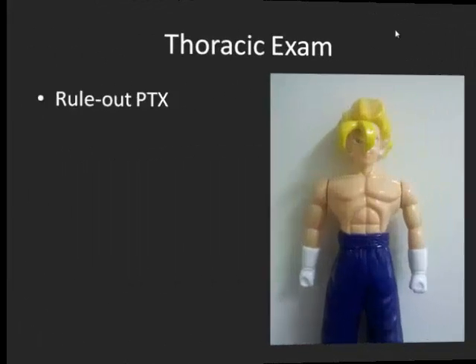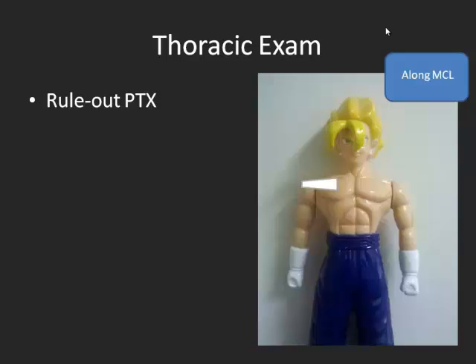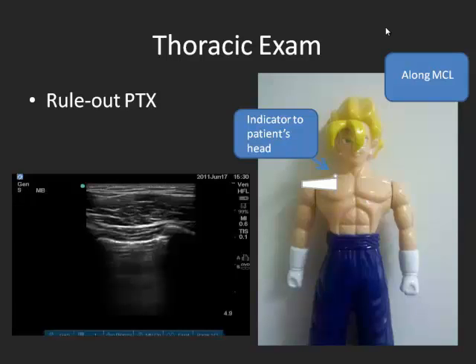In a thoracic exam, the main thing you want to do is rule out pneumothorax. This is a quick and easy test everyone should be able to do. The patient should first be lying down flat so that any air comes to the surface of the chest. If they are sitting up, you may miss a pneumothorax because air will sit up in the apices. You go along the midclavicular line between two ribs with the indicator pointing towards the patient's head. You will see rib shadow, rib shadow, tissue, and then lung.